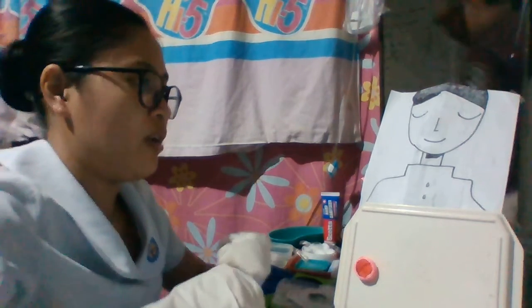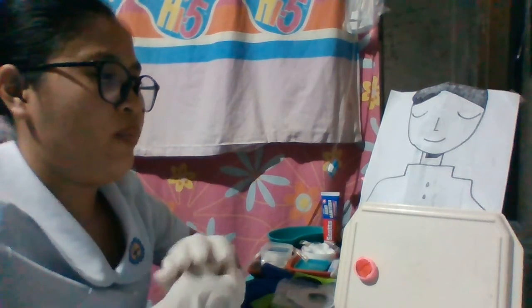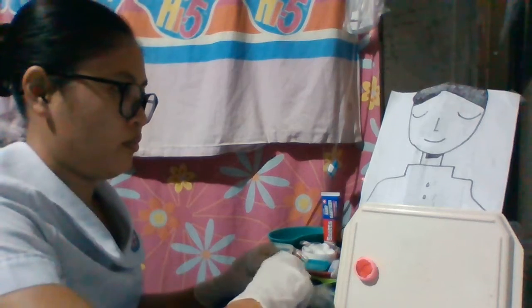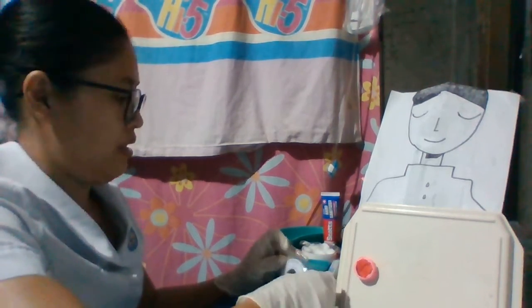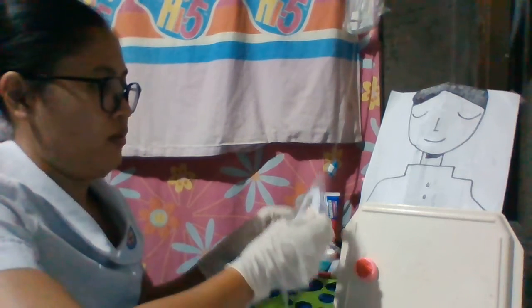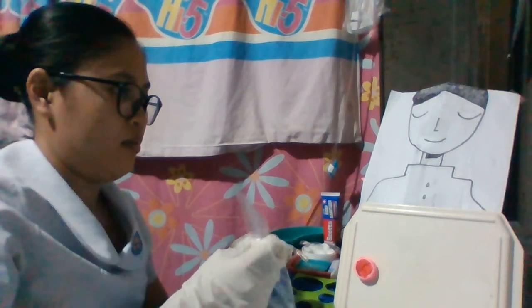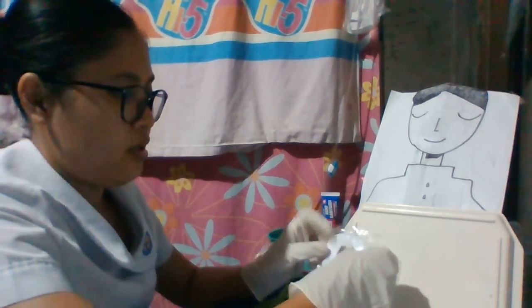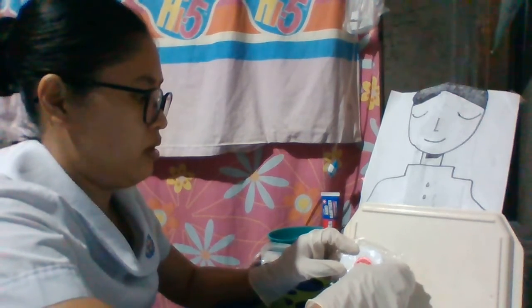Then afterwards, apply the pouch to the skin after cleansing and drying the skin. We're going to make it ready. Then we're going to hold it in place for 1 to 3 minutes.